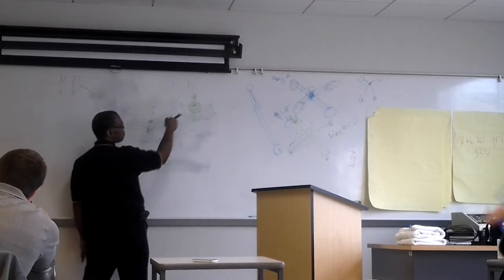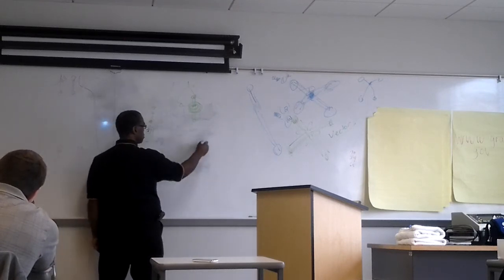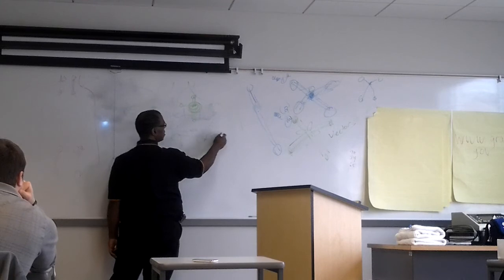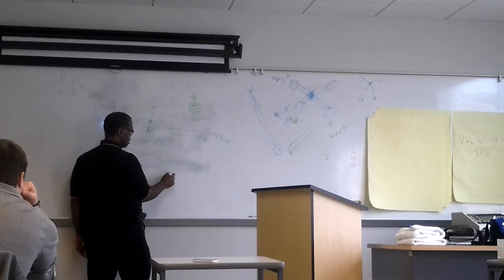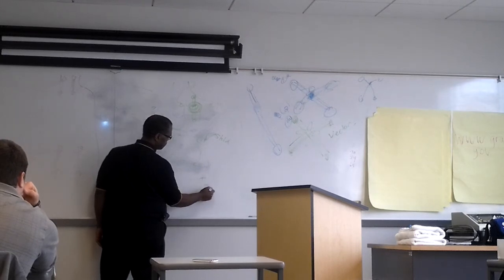Or I can manually find the area. On that pad over there, it says target on that pad. We'll say over here, because you'll see this on the screen. We'll say over here is the shoulder. This is the head right here. This is the low back. And this is that right hip over this side.